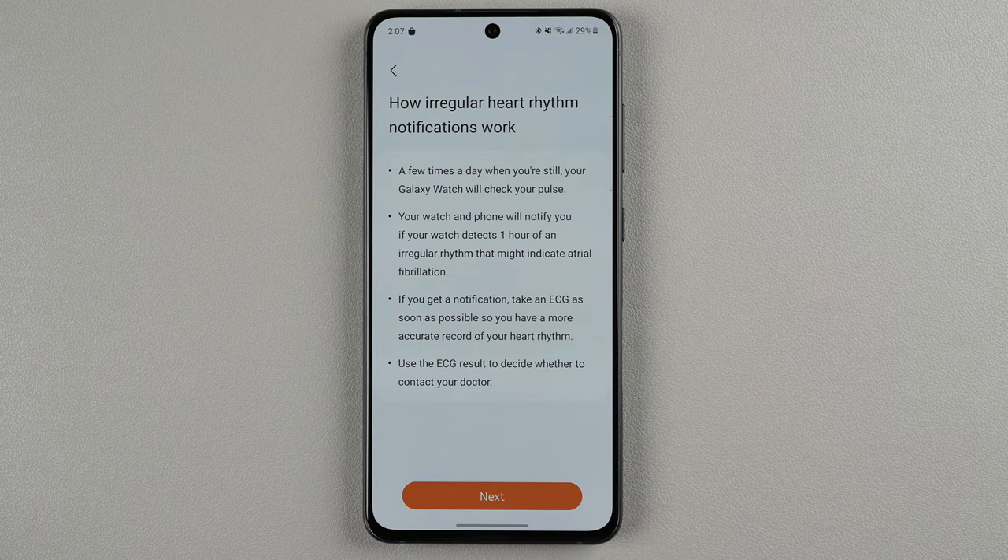So how irregular heart rhythm notifications work: a few times a day when you're still, your Galaxy Watch will check your pulse. Your watch and phone will notify you if your watch detects one hour of an irregular rhythm that might indicate atrial fibrillation. If you get a notification, take an ECG as soon as possible so you have a more accurate record of your heart rhythm. Use the ECG result to decide whether to contact your doctor.